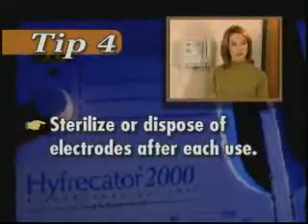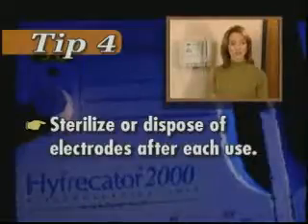Tip 4. To prevent patient-to-patient transfer of infectious organisms, make sure all electrosurgical electrodes are either disposable or sterilized after each use.